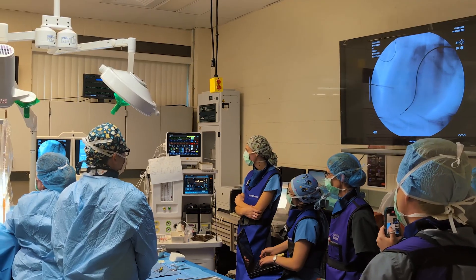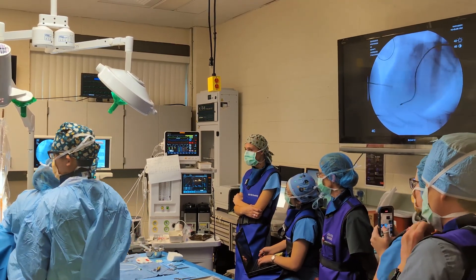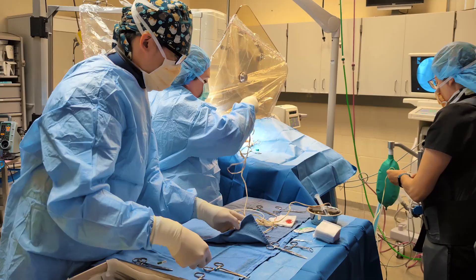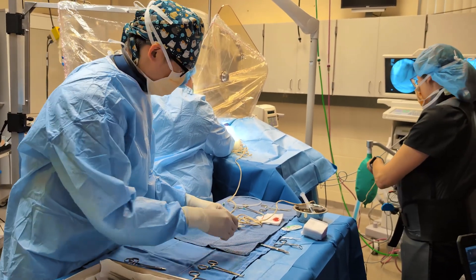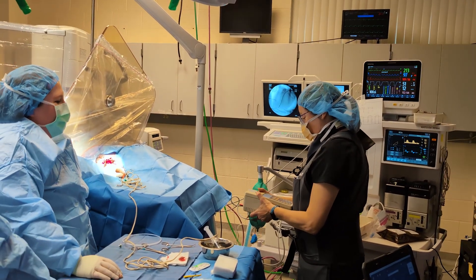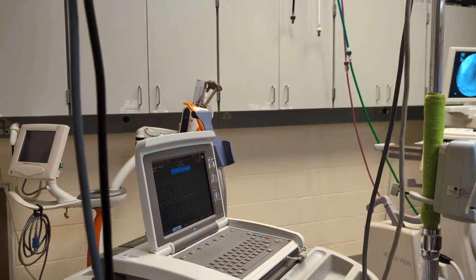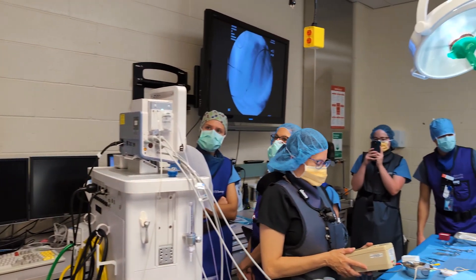In dogs, we typically do right ventricular pacing. We feed the lead down into the apex, or the depths of the right ventricle, in order to pace the heart. After we've fed the lead down into a location that looks appropriate on the fluoroscopy, we hook the lead up to a machine that allows us to test different parameters — reading off numbers for the minimal electricity required to generate a heartbeat and the impedance to electricity flow at that location.